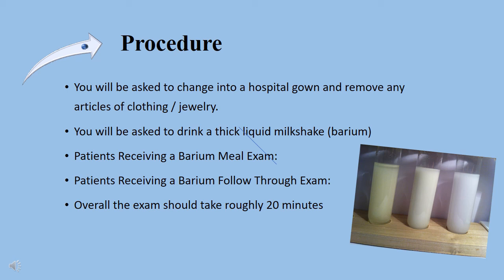For patients receiving barium meal exam only, you will be required to take a number of chest x-rays, often at different angles, to get a better view of your esophagus. You will be asked to remain still and may be asked to hold your breath during the x-ray.